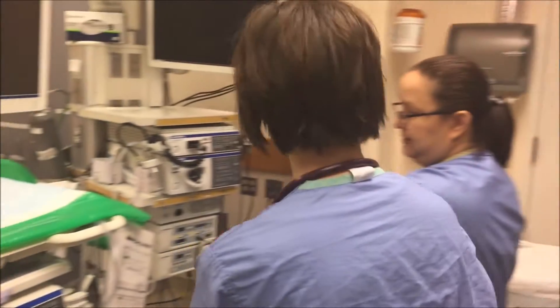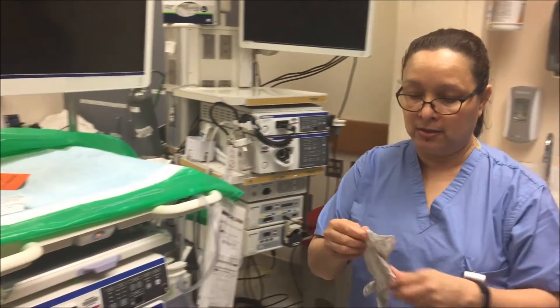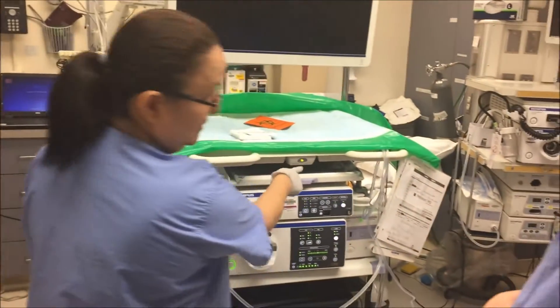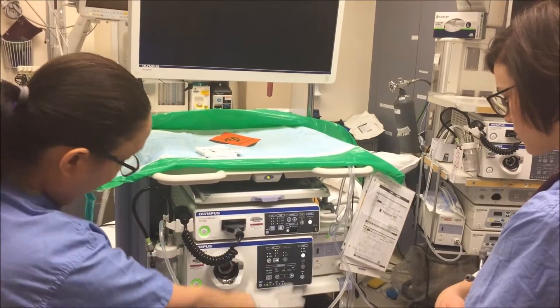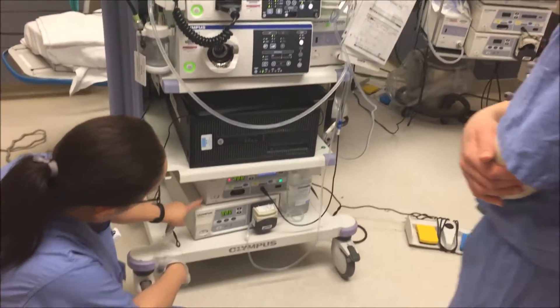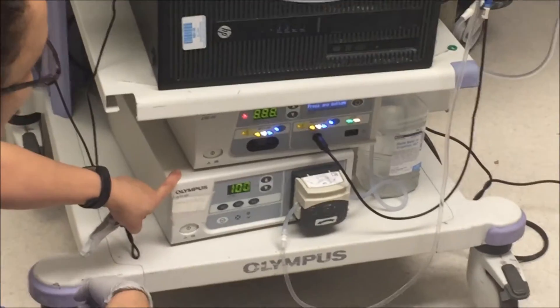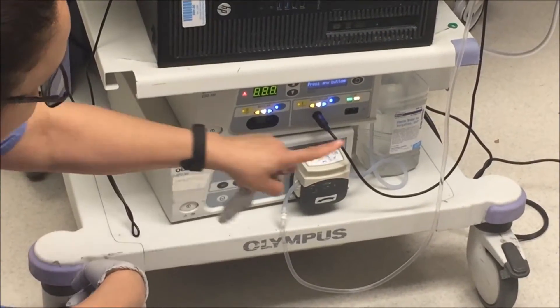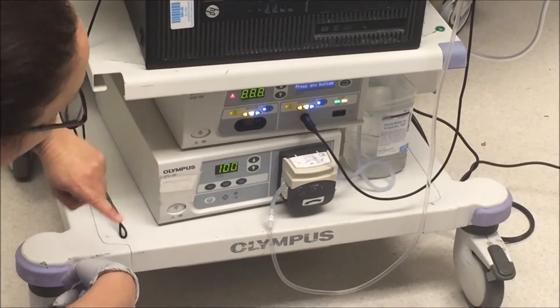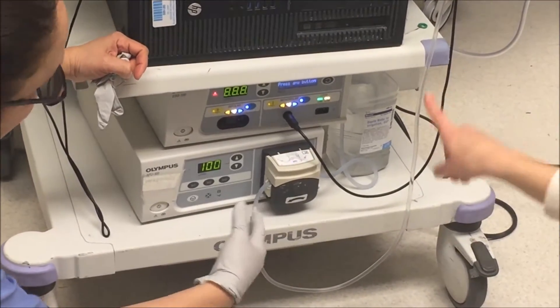You can put this aside because at the end you're going to be using that. Then we take the scope and we're going to turn it on from this — this is the button that will turn everything. This is the part of the computer that will give you the irrigation, that will give you the water. It will go through the scope and the doctor will be able to clean inside, and that will already be set up.